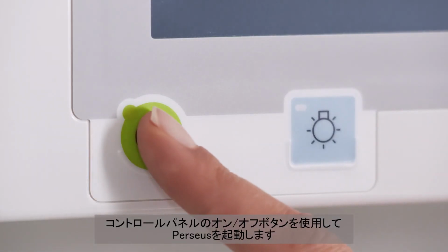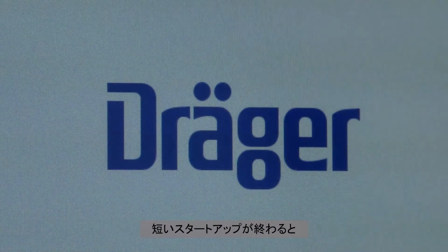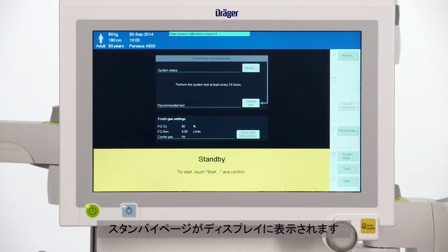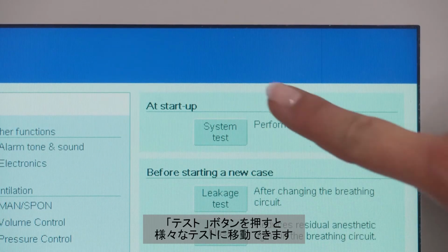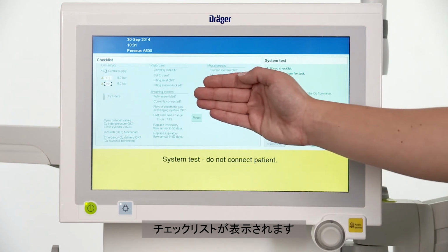The on and off button on the control panel is used for starting the Perseus. After a short startup phase, you will see the standby page on the display. Pressing the test button will take you to the different tests. After pressing the system test button, a checklist is displayed.